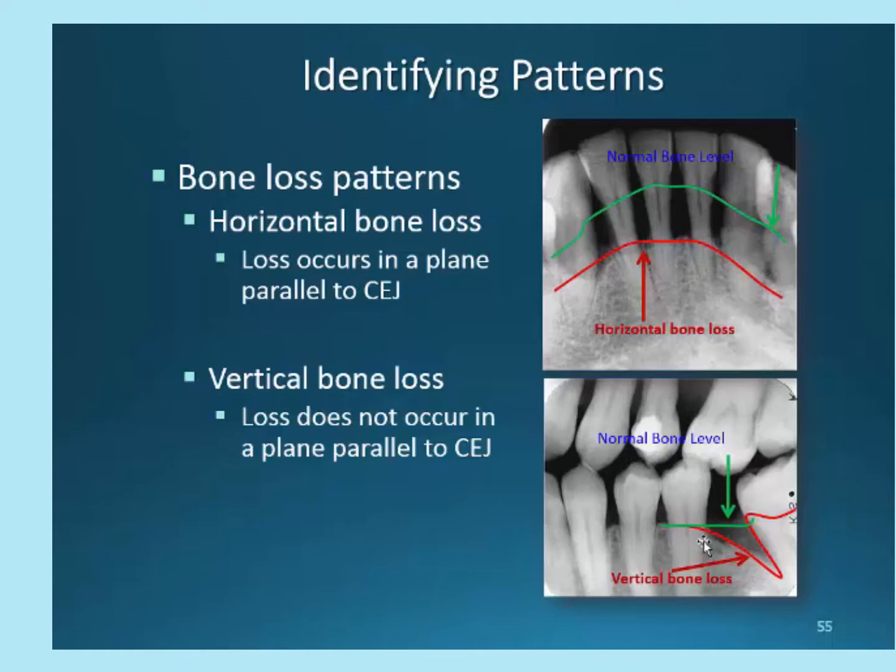Note that I'm identifying the horizontal level where the bone originally was, and then the peak to the vertical bone level. We have an image here that is actually showing some level of bone on one area. Again, this defect may only be present on either the facial or lingual aspect of a tooth, and probing depth would be needed to determine that.